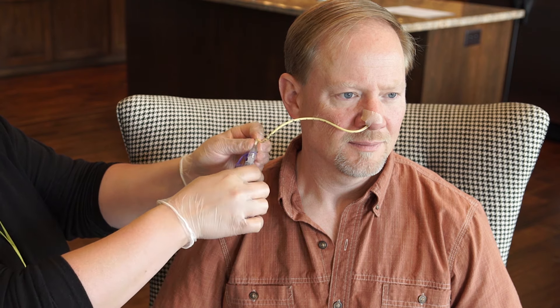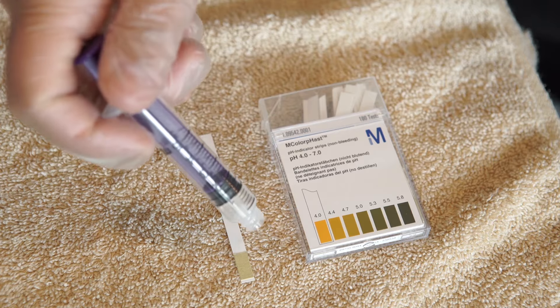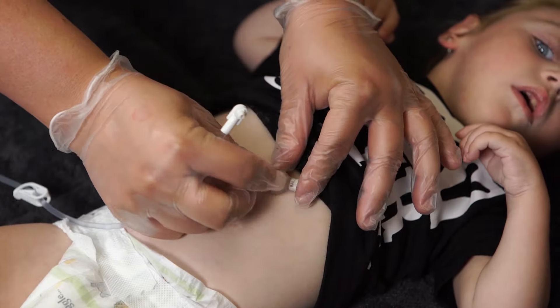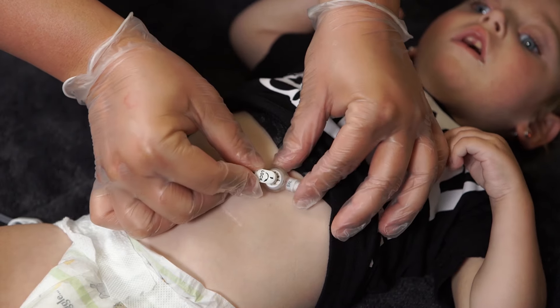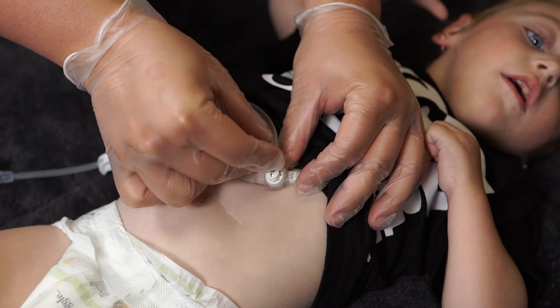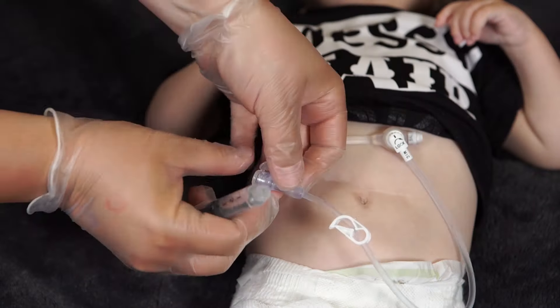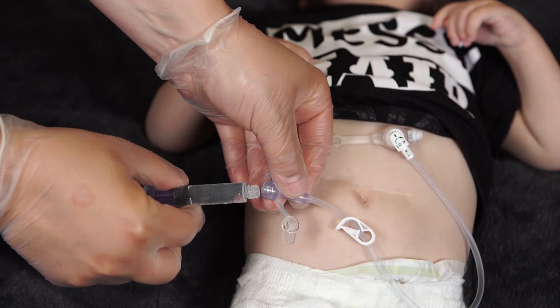For a refresher on how to check the placement of an NG or oral tube, click here to watch the video. If you're using a low-profile feeding tube, attach the primed feeding extension to the feeding tube. Flush the feeding tube with the prescribed amount of water.